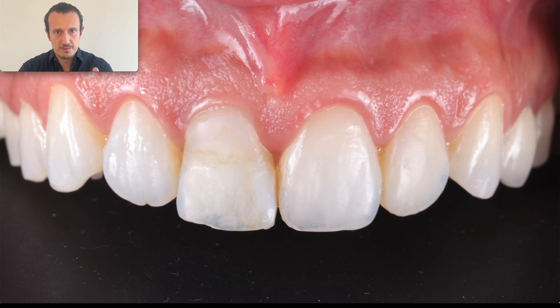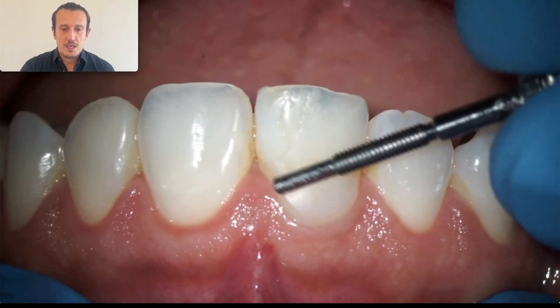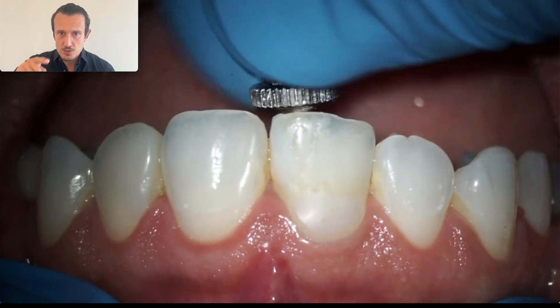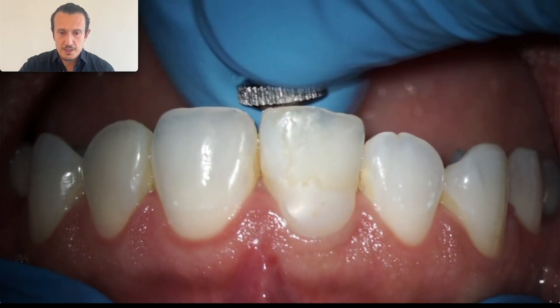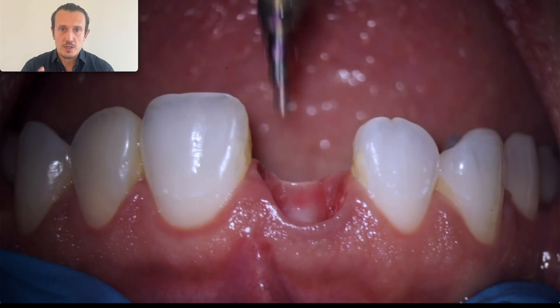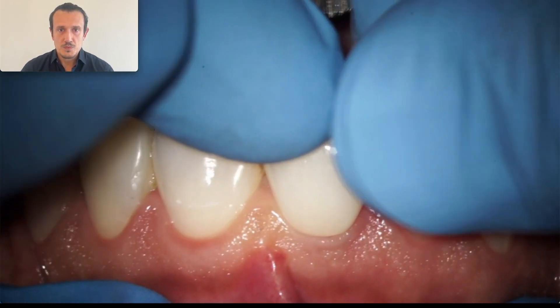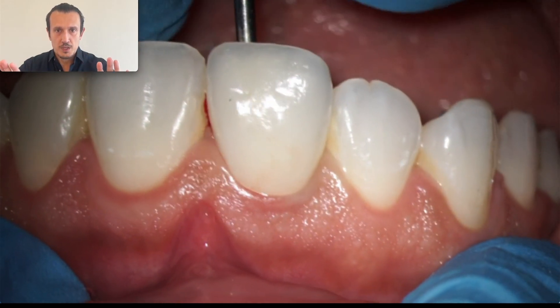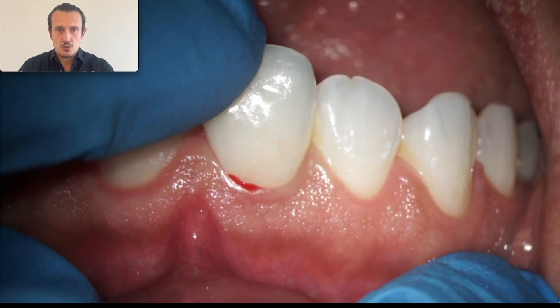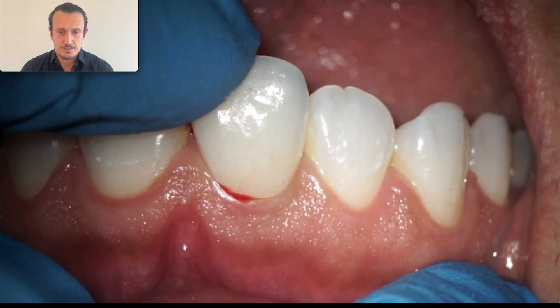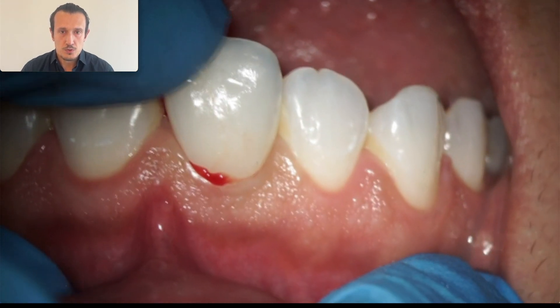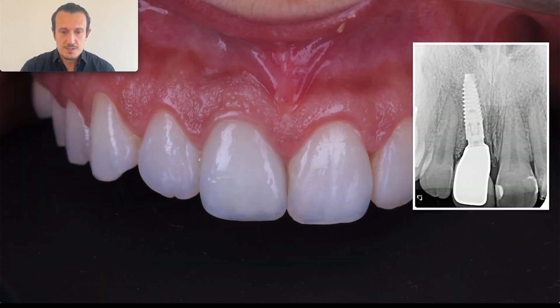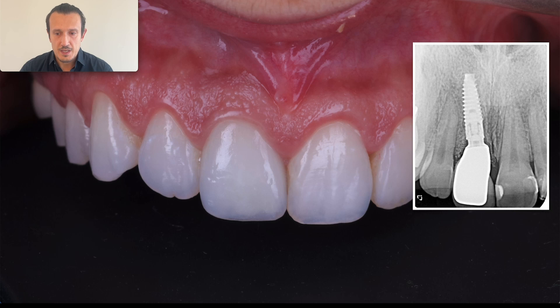On the day of insertion of the final crown, you can see the gingiva is not yet perfect — the zenith line and gingival outline are not ideal. But you can see the effect when we screw in the restoration: because it's the last 10%, we immediately change the form of the gingiva using the form of the restoration. You can see how it changes immediately as we screw the crown in.